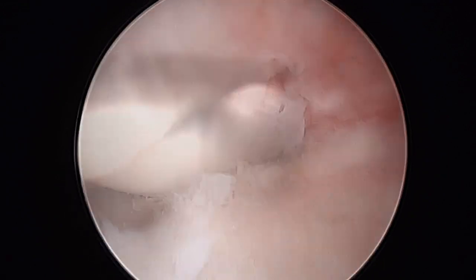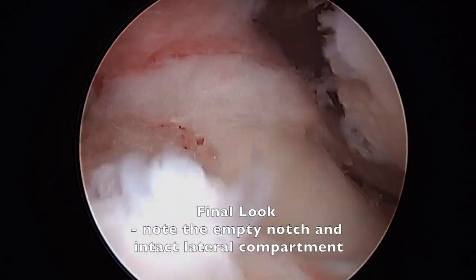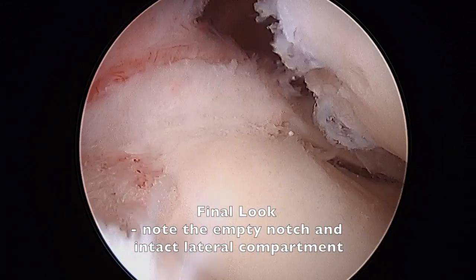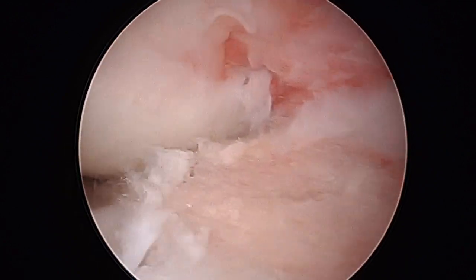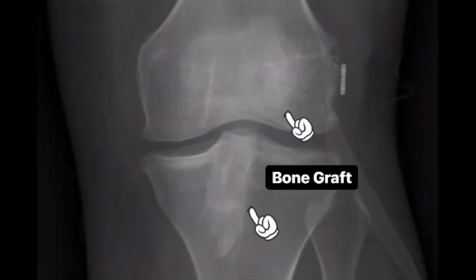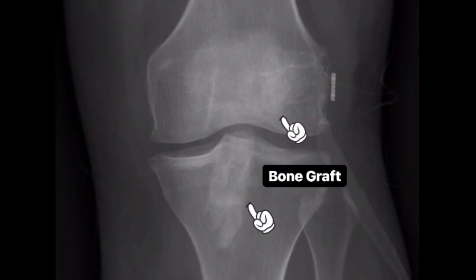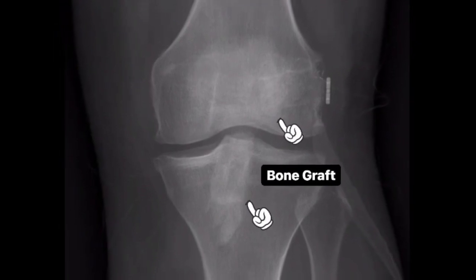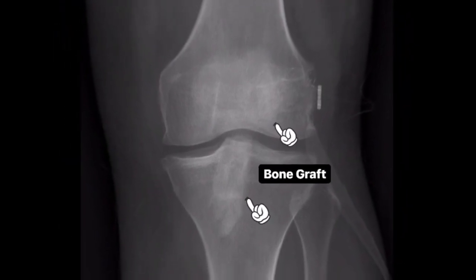Here is a final look at the tibial graft. The goal is now to allow the patient's body to incorporate her own bone within these tunnels, and when appropriate healing is confirmed, the second stage ACL reconstruction may be performed.